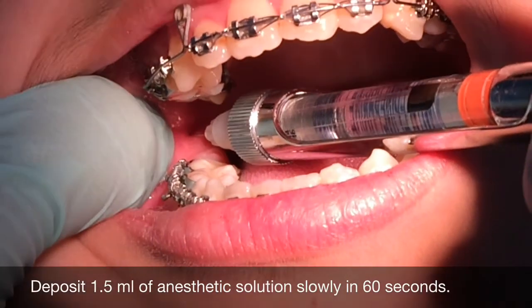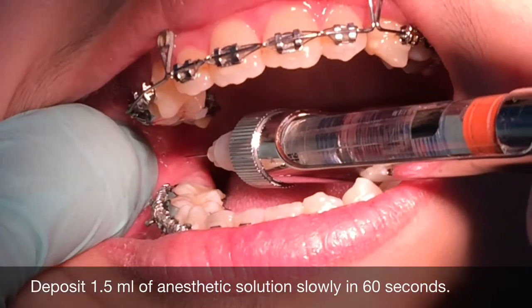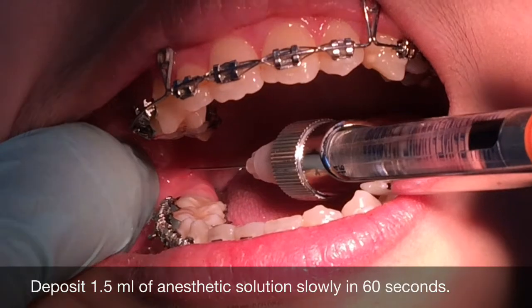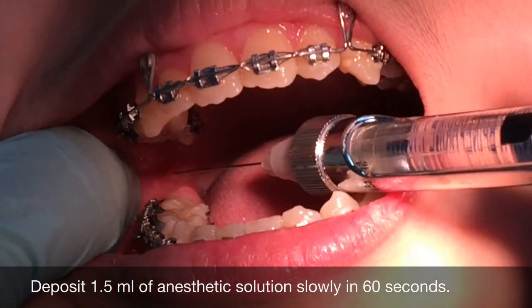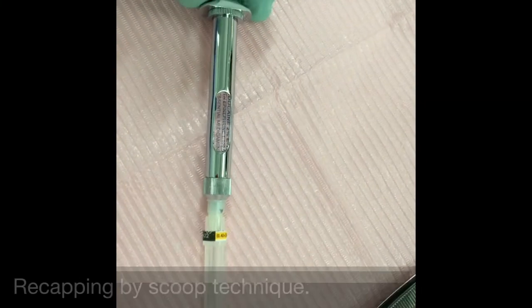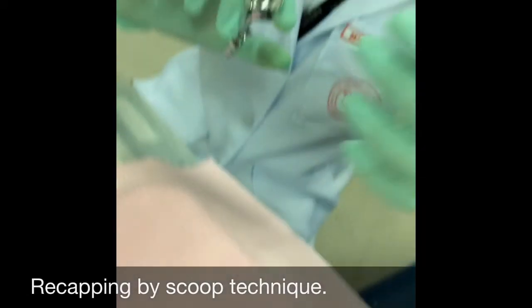Then the needle is withdrawn slowly. Make the needle safe by the scoop technique.